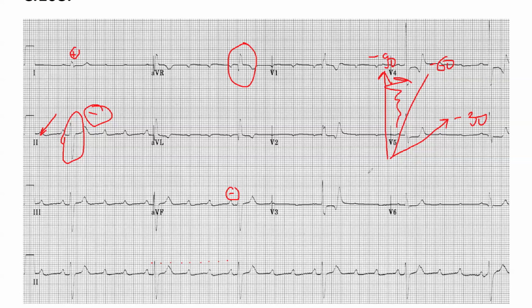That could be due to a hemiblock. Which one? If it's a left deviation, there'll be a left anterior hemiblock. Very good. Somebody studied. Yes, left anterior hemiblock.